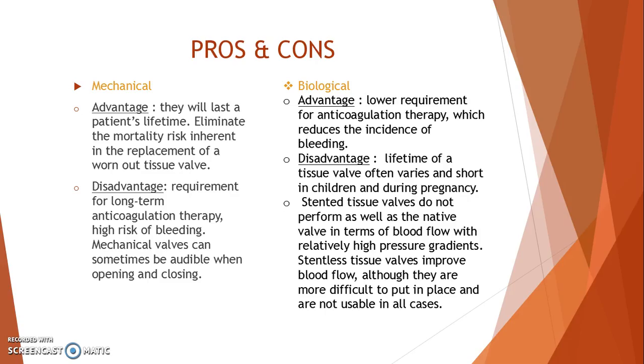Lastly, I will tell you the pros and cons of using a mechanical heart valve and a biological heart valve. For the mechanical heart valve, the advantage is that it will last the patient's lifetime and eliminate the mortality risk inherent in the replacement of a worn-out tissue valve. Meanwhile, the disadvantage is that he or she will require long-term anticoagulant therapy, so there is a high risk of bleeding. Besides that, a mechanical valve can sometimes be audible when opening and closing.